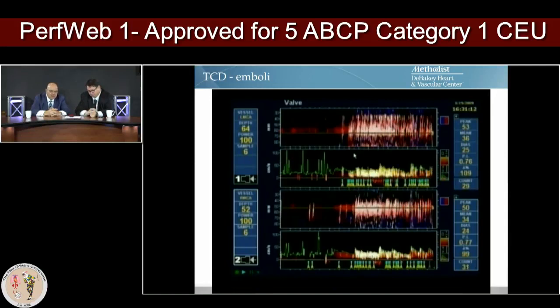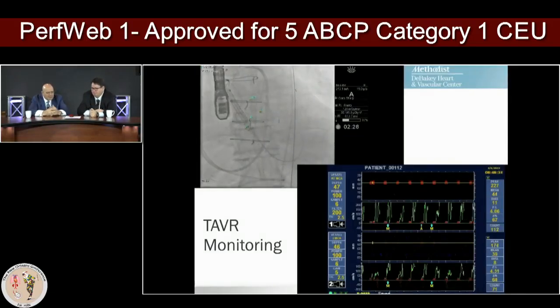And that was emboli or air, of course. Probably this is TAVR, it's just that flow comes. So that air had to have been in the catheter, the deployment catheter, the valve itself. I mean, it had to come from somewhere. It certainly didn't just create itself. And I hope it's just air, but definitely there's debris. So you're saying it's air, but it could be particulate.